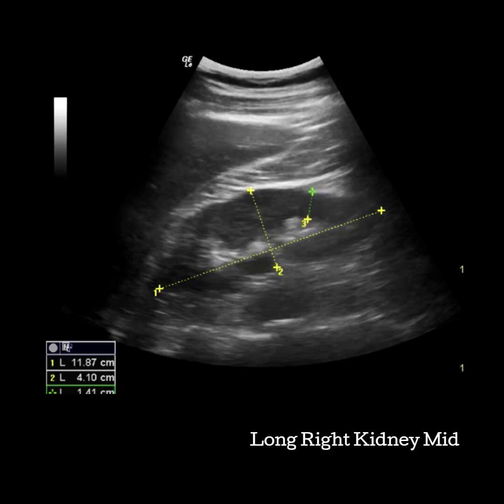The average size of the kidney is 9 to 12 centimeters in length; however, most healthy adults will average closer to the 11 centimeter range. Take a mental note of the length measurement. You do not want adult kidneys to be more than 2 centimeters different in length.